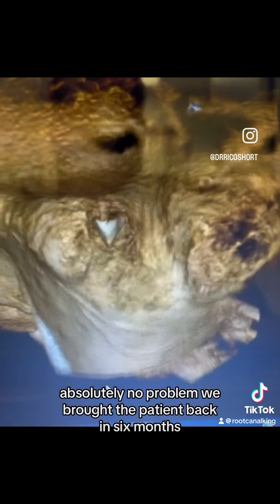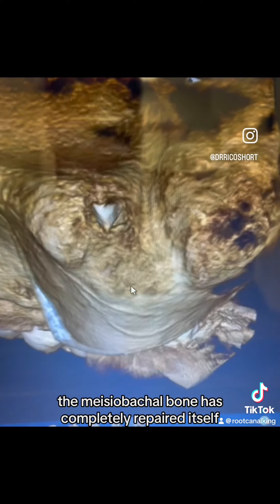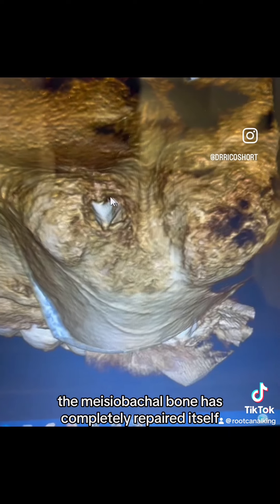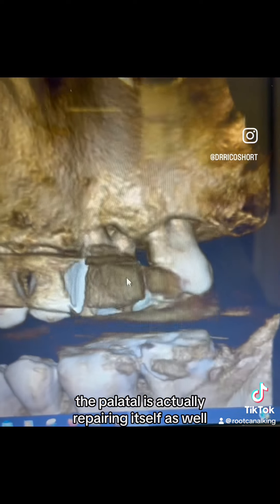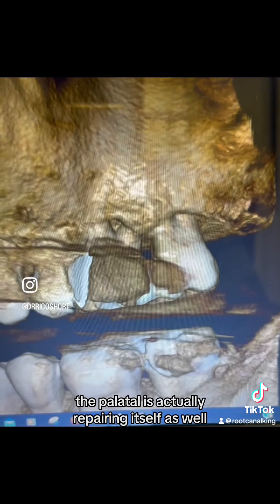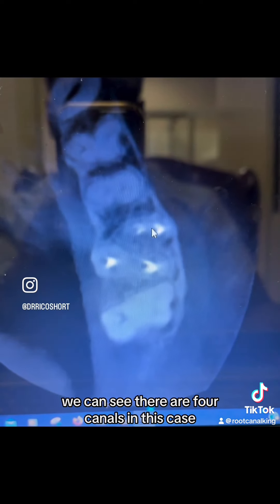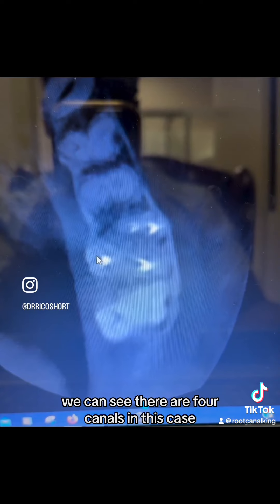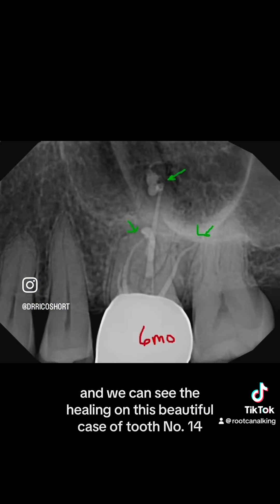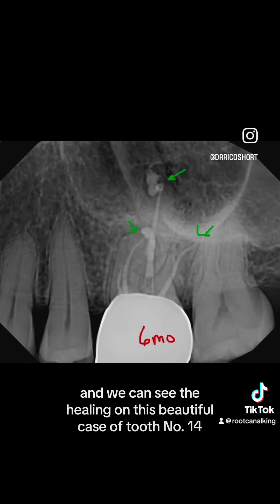We brought the patient back in six months — look at this beautiful healing. The mesial buccal bone has completely repaired itself, and the palatal is also repairing itself. We can see some of the bioceramic sealer. We can see there are four canals in this case and beautiful healing on tooth number 14.